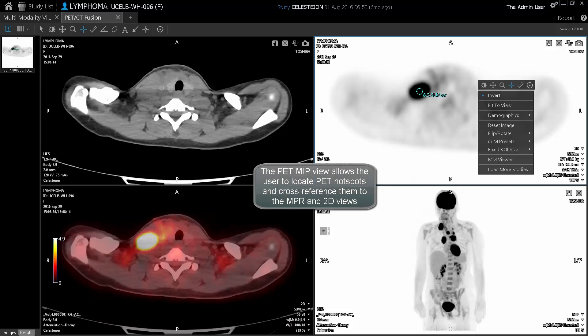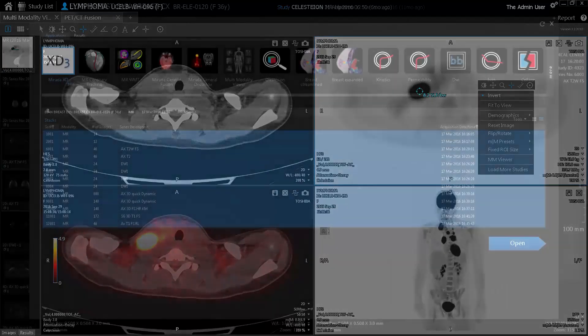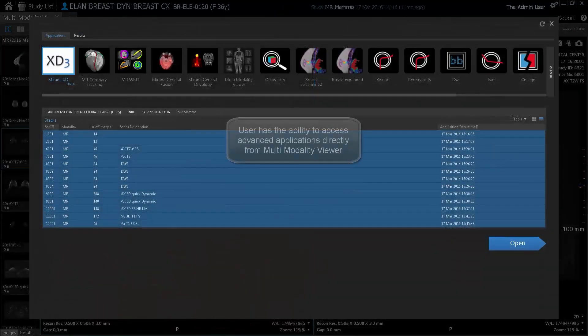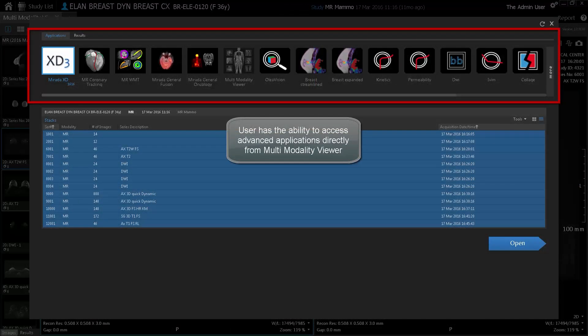The PET MIP View allows the user to locate PET Hotspots and cross-reference them to the MPR and 2D Views. The user has the ability to access advanced applications directly from Multi-modality Viewer.